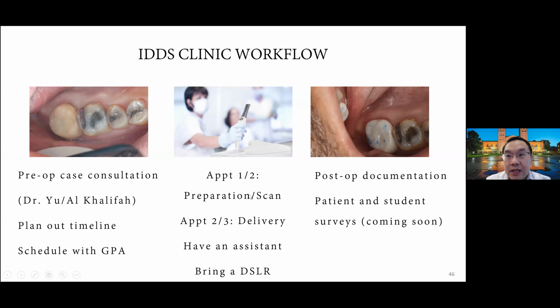Then prep the tooth, make sure everything is okay, pack the cord, and then we scan. After we scan, make sure the scan is good. The faculty is going to help you evaluate your prep to see whether or not you have enough reduction. If everything checks out, we don't need to change anything. If we need to modify a little bit, we rescan the teeth.